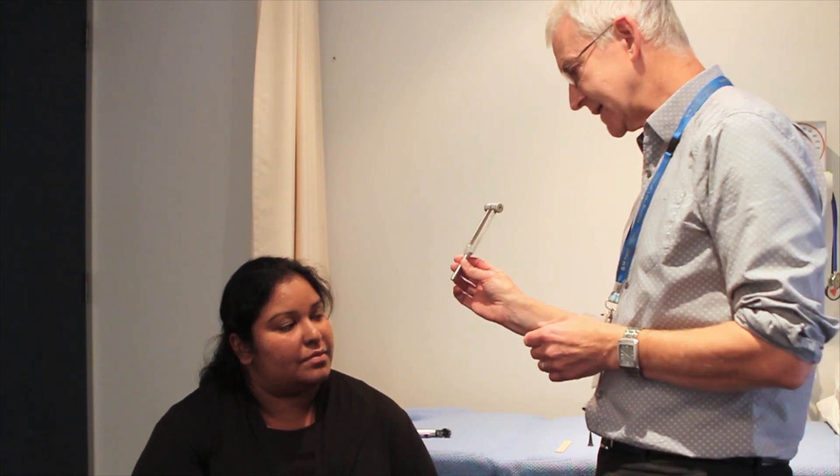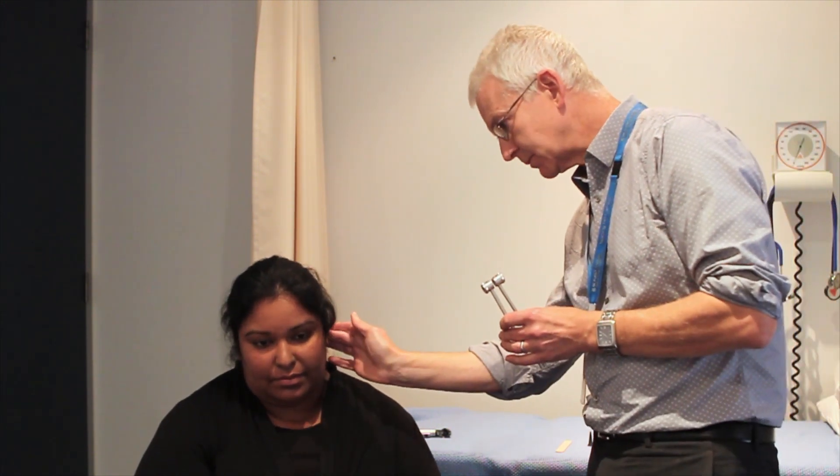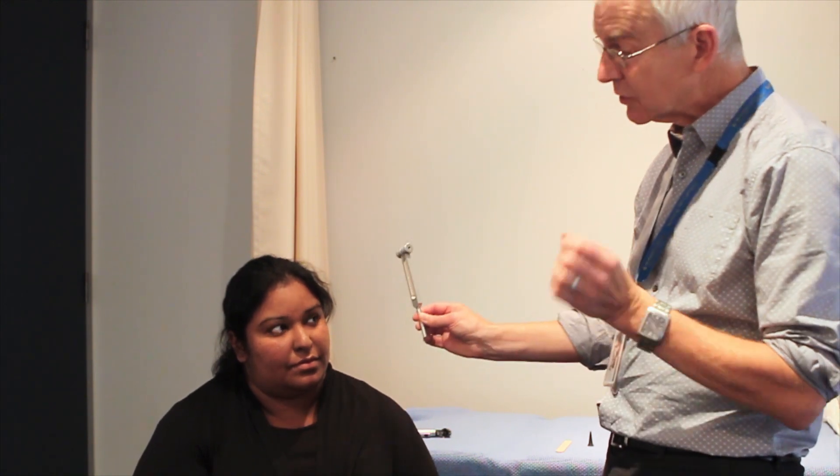So Naroshi, I'd like to do a couple of tuning fork tests on your ear, and this is particularly helpful if one of your ears you notice is rather deaf. The way I activate the tuning fork is by just knocking it against my knee, and you can then hear it and feel it vibrating. I'm then going to place it initially against your bone — this bone here, the mastoid bone — and I'd like you to tell me when you hear the noise go. And then I will straight away move the tuning fork to your ear to see if you can still hear some noise at that point. Is that clear? So here we go with the Rinne test.